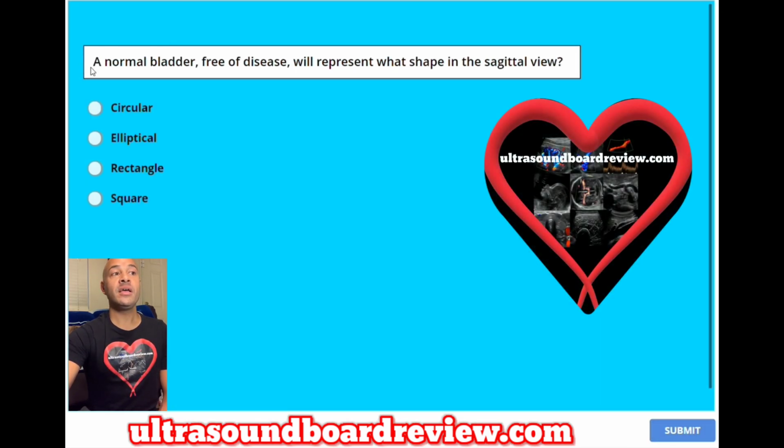Question 146. A normal bladder free of disease will represent what shape in the sagittal view? A, circular, B, elliptical, C, rectangle, or D, square? The answer is B, elliptical.